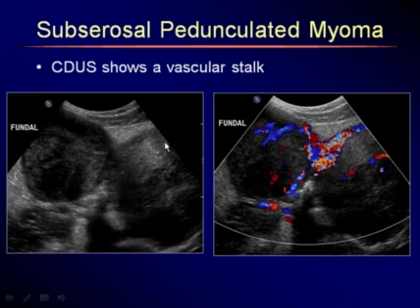Here in this case, this was the uterus. This is a pedunculated myoma. There was a separate ovary, and now we confirm that the blood supply to this mass is coming from the uterus. If you don't know the origin of a mass, it's very helpful many times to find what vessel is feeding it, and that helps you sometimes define the origin. We know this from CT, for example. If there's a pelvic mass, and we can trace the gonadal vessels, the ovarian vessels, to that mass, then it's most likely of ovarian origin. It's a fairly good assessment.